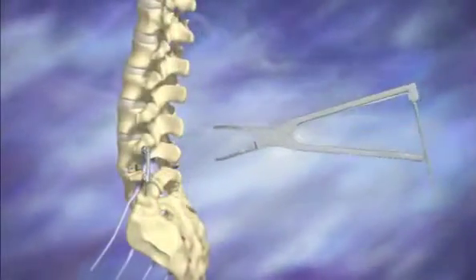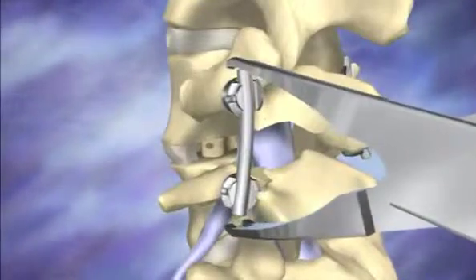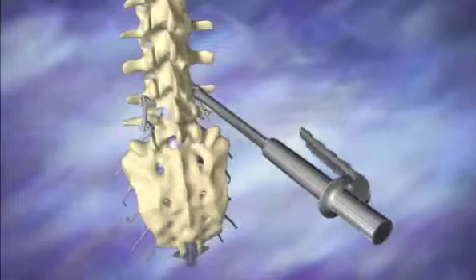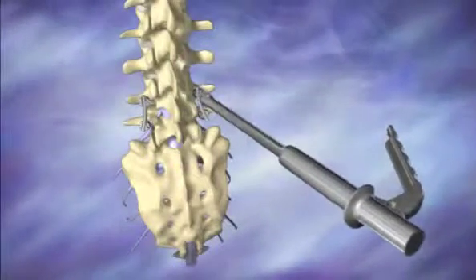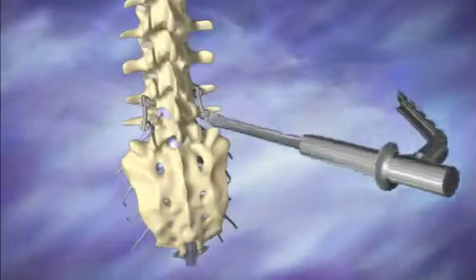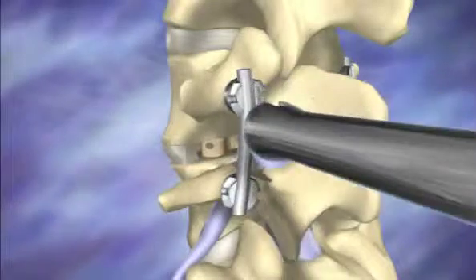Once implant placement is confirmed, bilateral compression is achieved using the compressor in the mesa spinal system. With the mesa screws partially locked, the compressor is removed. The quick locker, utilizing zero torque technology, is used to finally lock the screws without applying torsional stress to the spine.